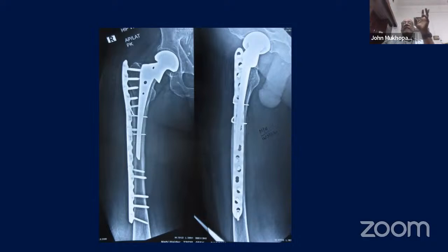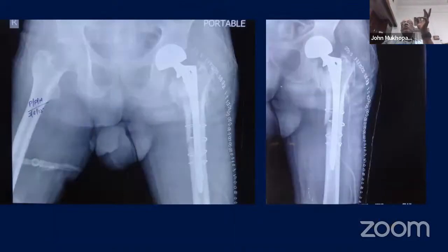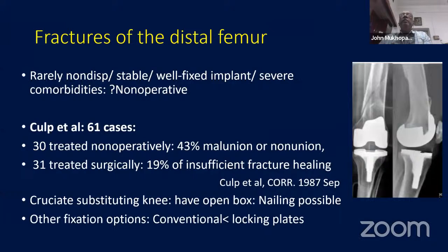After this fracture has healed. On the other side, this was the other case which we showed where you know that the prosthesis is loose. You would have to do something like a distal hold stem with wiring for the fracture. So this was a long revision stem, going through the fracture area, holding on to the bone in the distal part and wiring for the fracture along with the prosthesis, keeping the fracture stable and allowing it to heal. Okay.